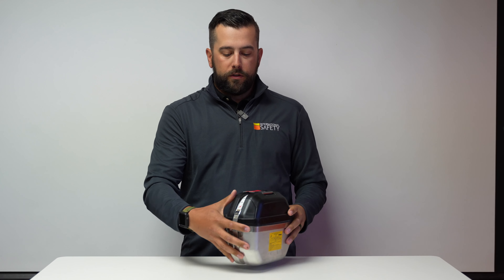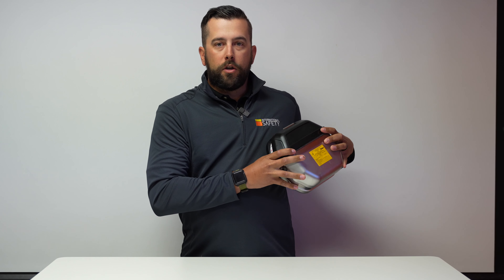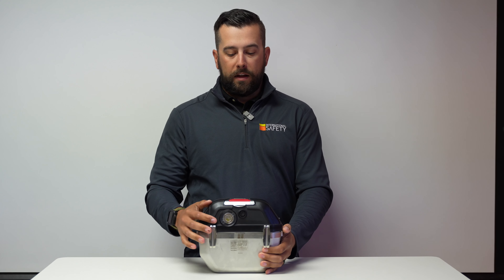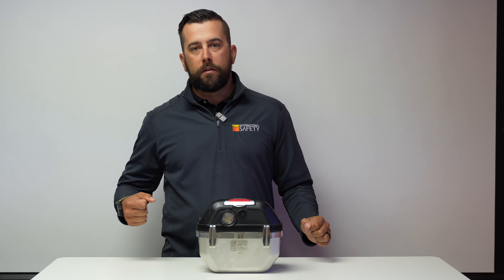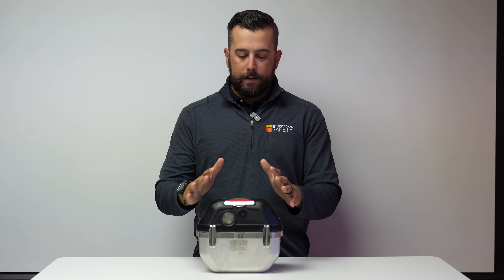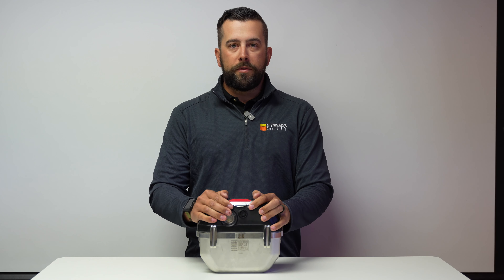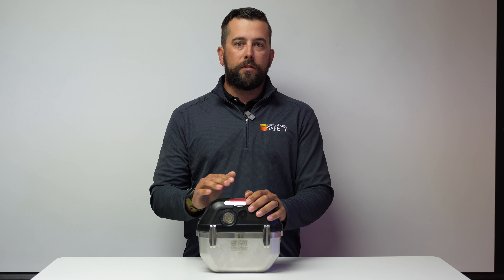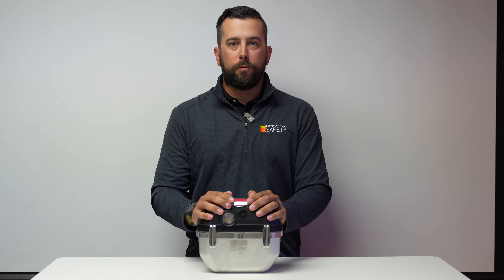You can get this unit so that it attaches to your hip. You can have a shoulder strap that attaches over your shoulder. Sometimes we see people have a hand strap where you can carry it around, put it down, do your work, grab it and move on. All these configurations are available through our website, and we can definitely help make recommendations based on the hazards in your environment and your workplace.